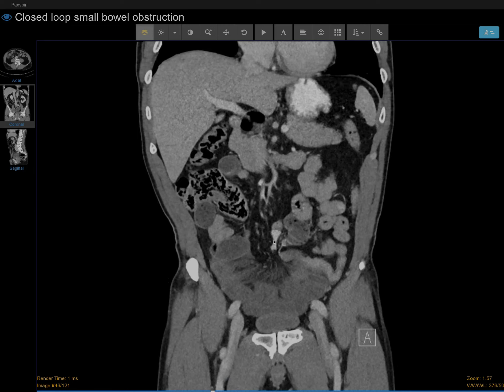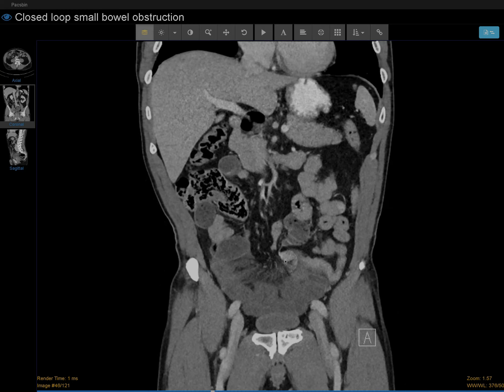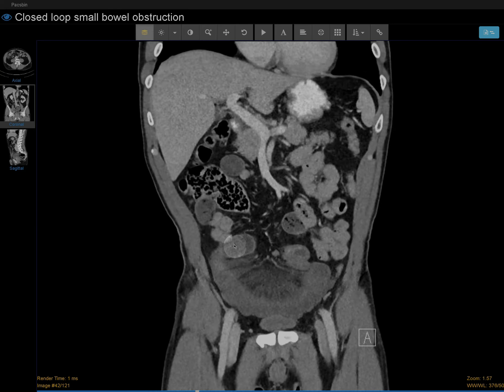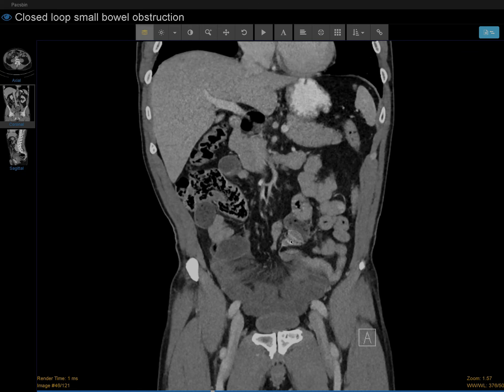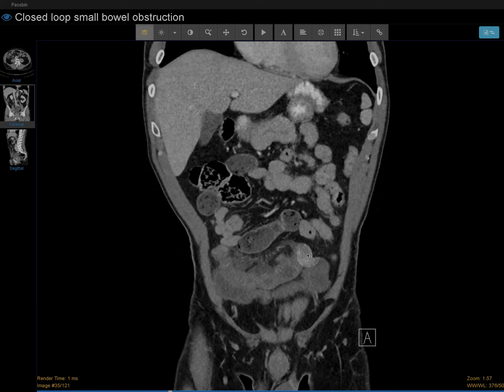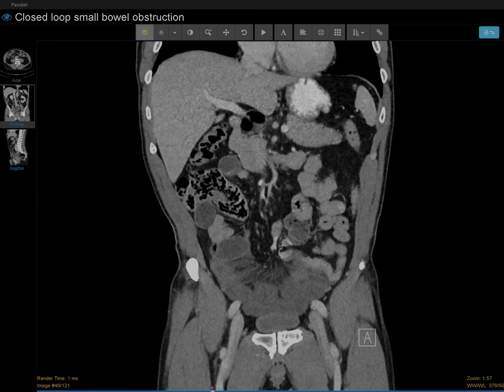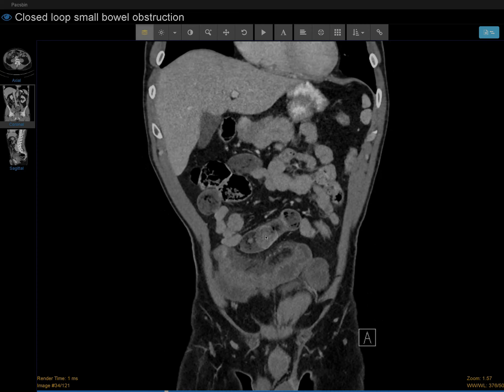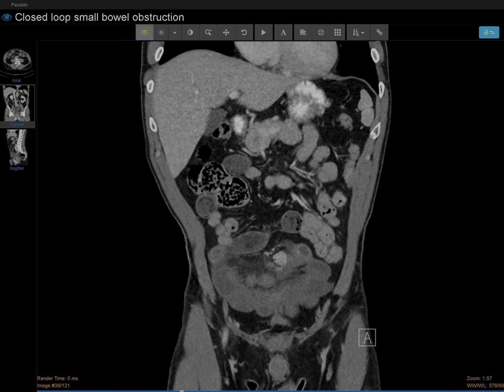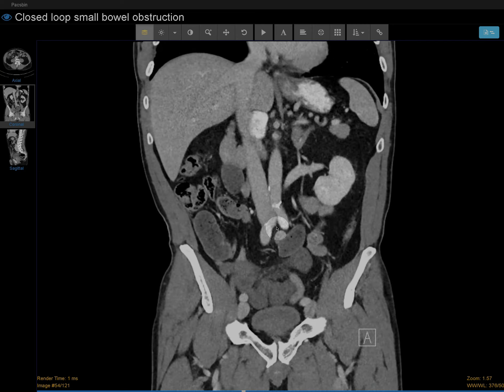The other loop of bowel should be pretty close to here. The other one is right here — it's abnormal. There's fecalization of the contents, and you have a birdbeaking right here. This is the abnormal loop of bowel. This is the distal bowel. From here is the proximal bowel — it's dilated, and because contents are not moving through, there's fecalization. After this is the distal bowel, and the distal bowel is normal.